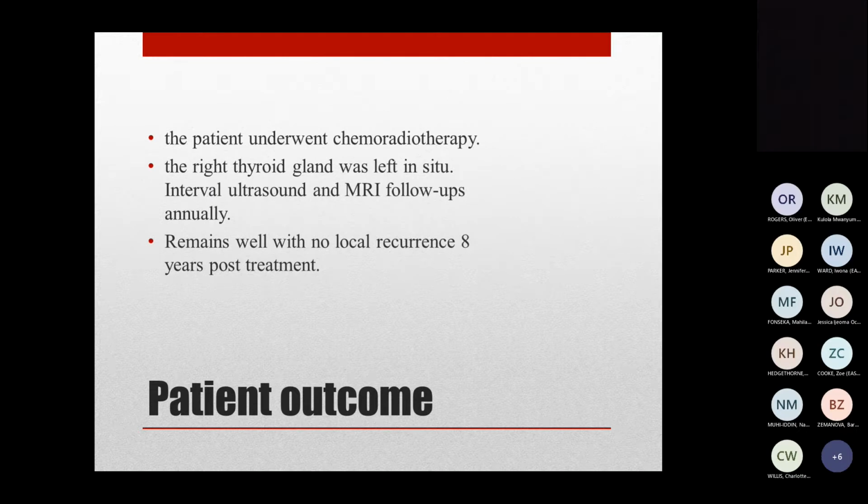So our patient did have chemoradiotherapy. The right thyroid gland was left in situ, and she underwent interval ultrasound and MRI follow-up scans annually. She remains completely well with no local recurrence at 8 years post-treatment.